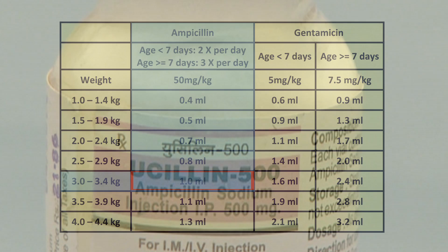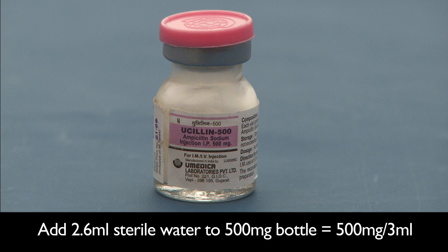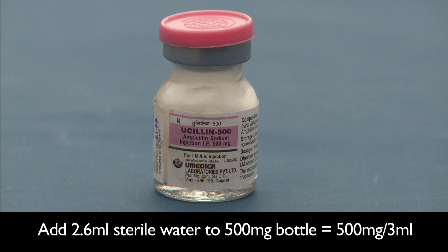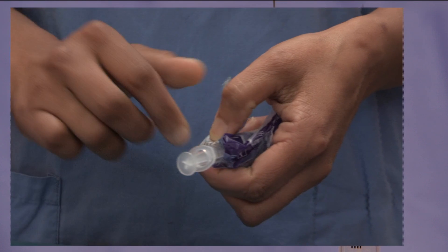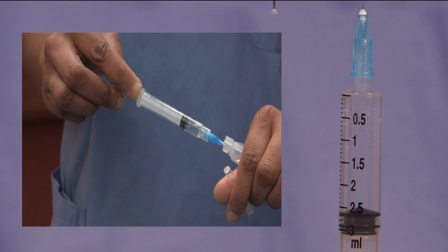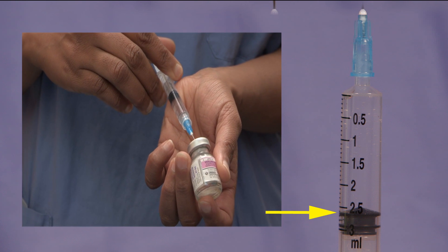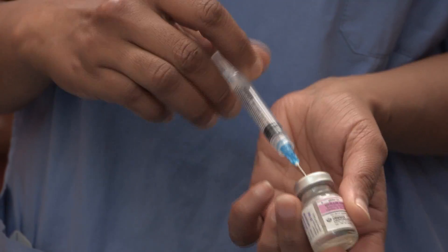Now, prepare the medicine for injection. Dilute the powder by adding 2.6 ml of sterile water to a 500 mg bottle of ampicillin. Using a sterile needle and syringe, draw up the 2.6 ml of sterile water and inject it into the bottle of ampicillin. Shake the bottle to mix the powder and water completely.